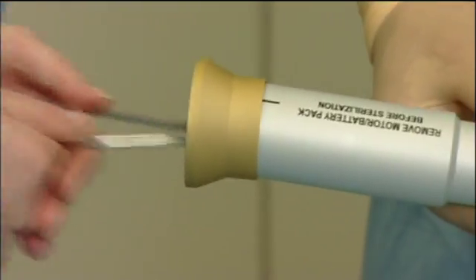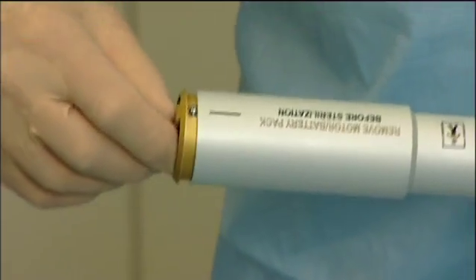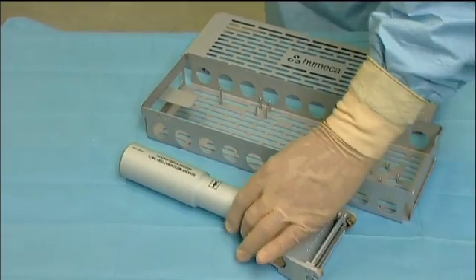Guided by marking lines, the non-sterile motor and battery are inserted while the sterile funnel prevents contamination of the outer surface. When the cartridge is completely inserted in the shaft, the open end is closed with a rear cap.